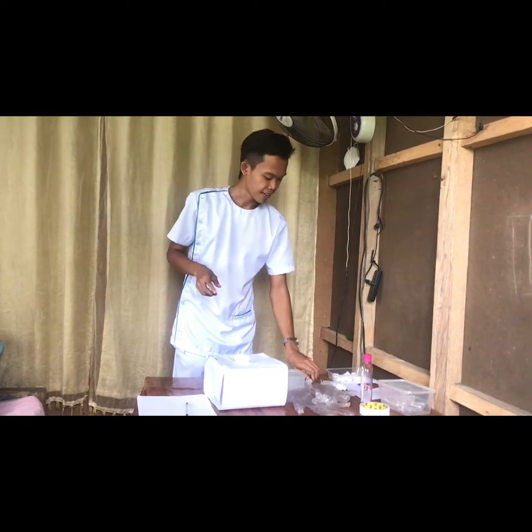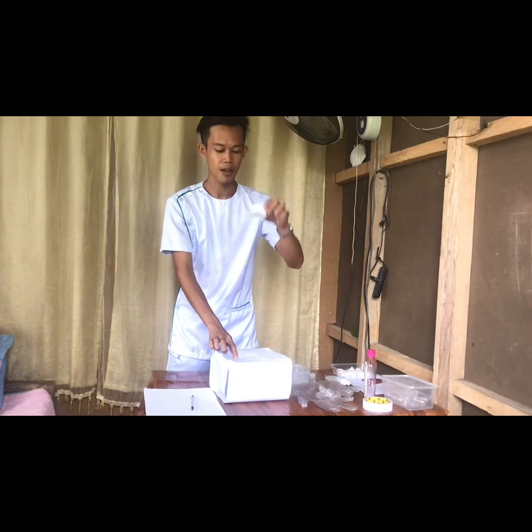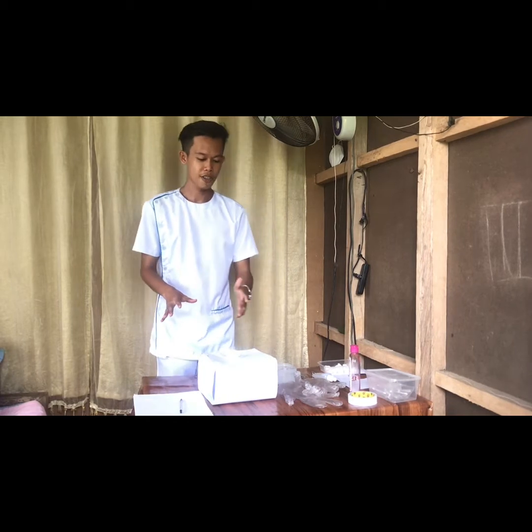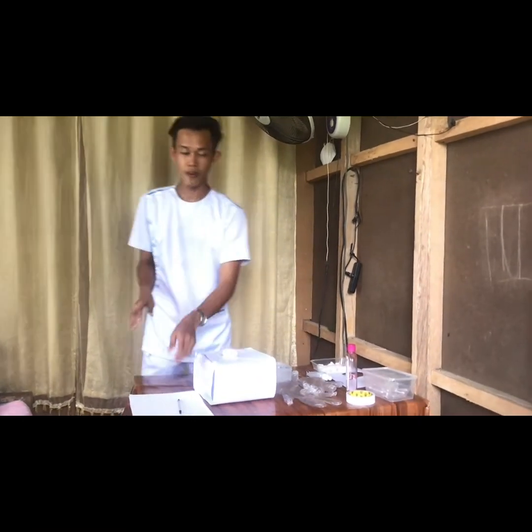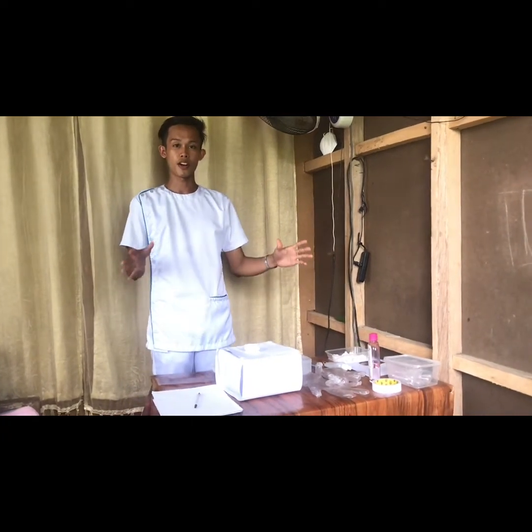We have a kidney basin, an improvised forceps, and the sterile gloves. We have a lubrication cup. As you can see, this box is what we call the catheter kit. Inside the catheter kit we have the drape, the fenestrated drape, the 10cc syringe, the catheter size 16, and the urine bag itself. I also have my medication order. Now we are done introducing all of the equipment for this procedure.